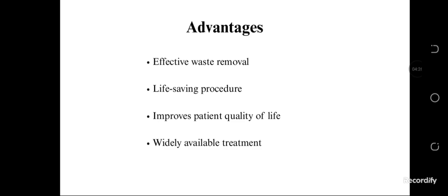The machines differ. For example, for chronic kidney injury, we use regular hemodialysis or SLED. But acute kidney injury patients need other equipment because they are hemodynamically unstable. So in that case, we use the CRRT machine. The machines may differ, but the process done in the machine remains the same. So assistive technology is included with these types of hemodialysis machines. It improves the precision and the accuracy, which saves the patient's life.